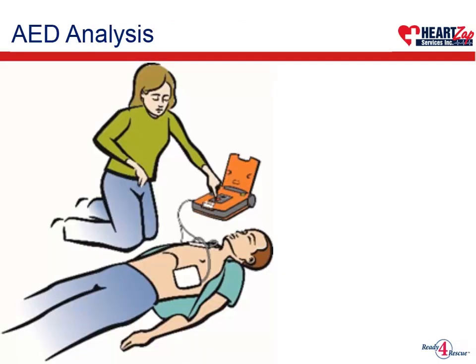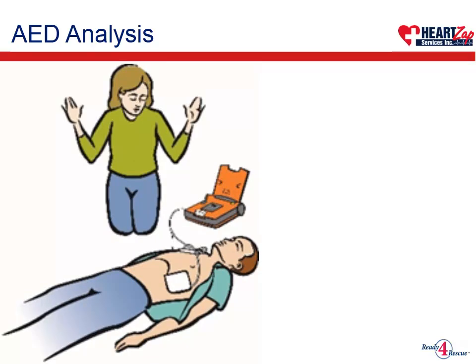Once the pads are in place and the AED is on, the AED will begin analysis immediately. It measures the electrical activity between the 2 pads and the heart and interprets if the heart is in a rhythm that needs to be shocked. When the AED is analyzing, make sure that no one is touching the casualty, as this will disrupt the analysis. Proceed as you are prompted by the AED.